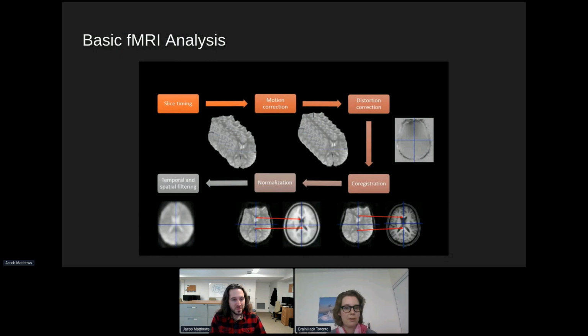And then you can work with those outputs to transform and get all your ROIs into a space in a way that's standard and reproducible, and probably using best practices.